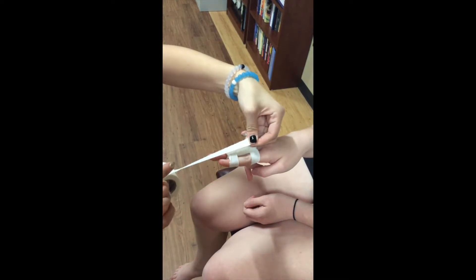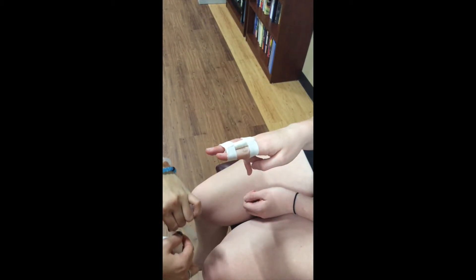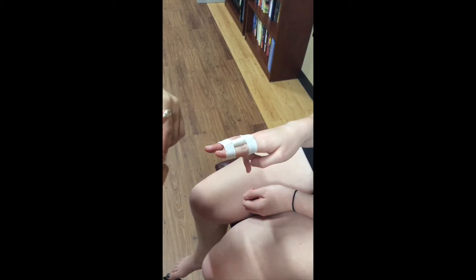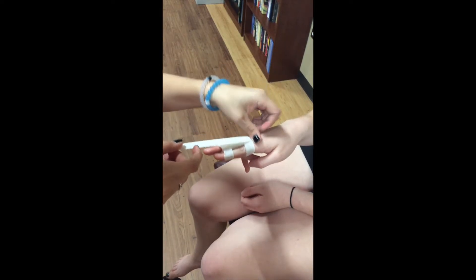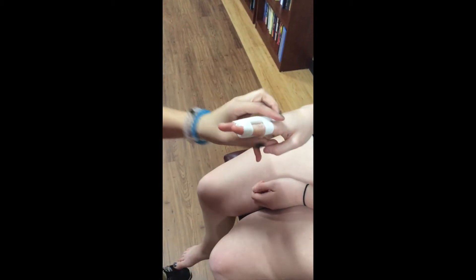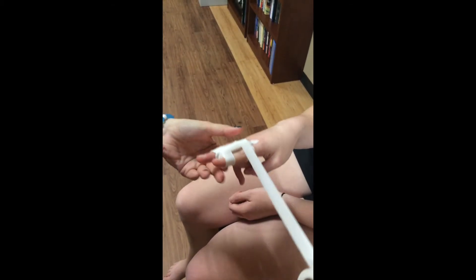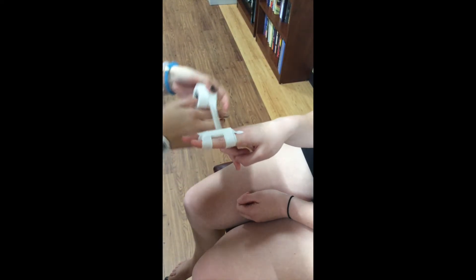While maintaining alignment of the fingers, tape the fingers together with half inch non-elastic tape between the MCP and PIP joints, between the PIP and DIP joints, and around the distal phalanx if necessary, with 3 to 5 circular strips with moderate tension. End the tape strips on the dorsal aspect of the fingers to prevent unraveling due to contact with equipment during activity. Do not place the tape directly over the joints.